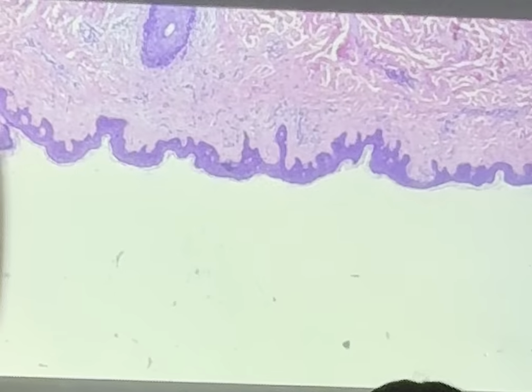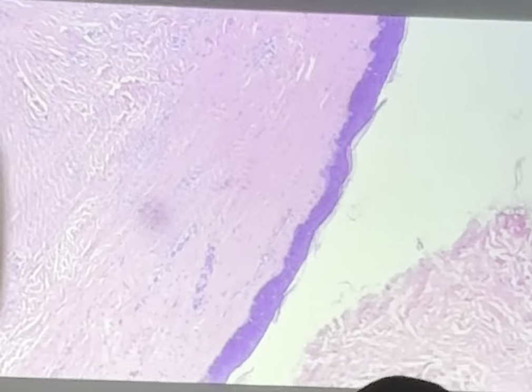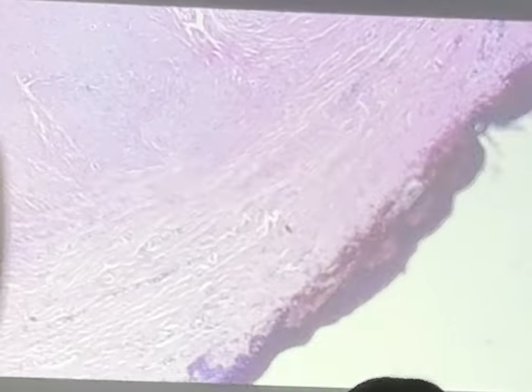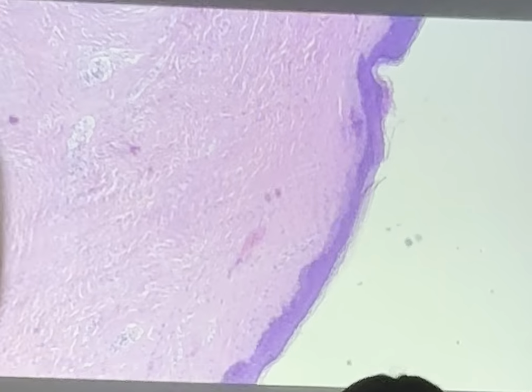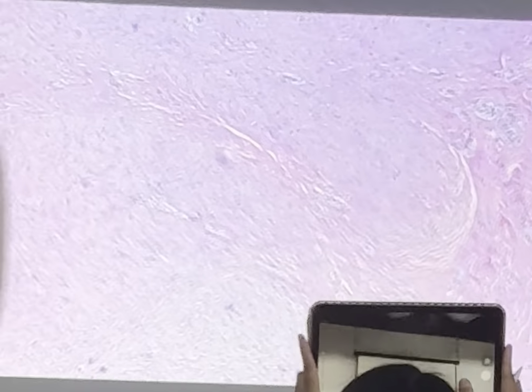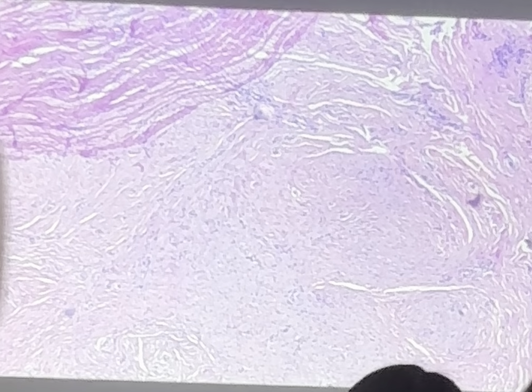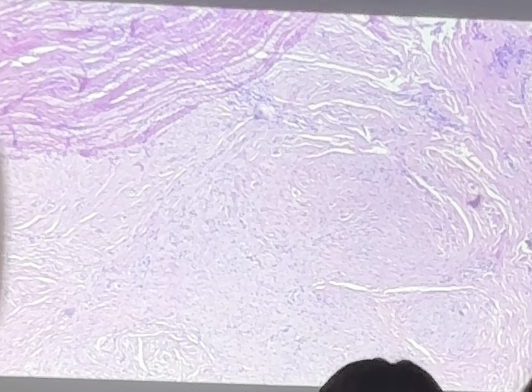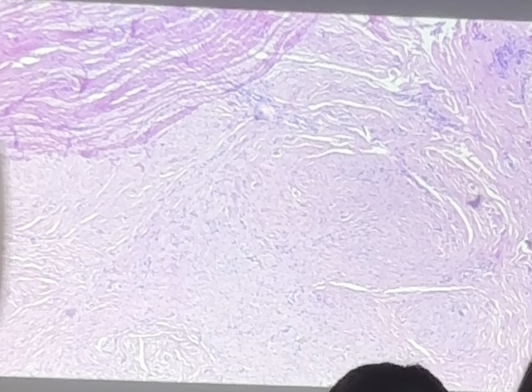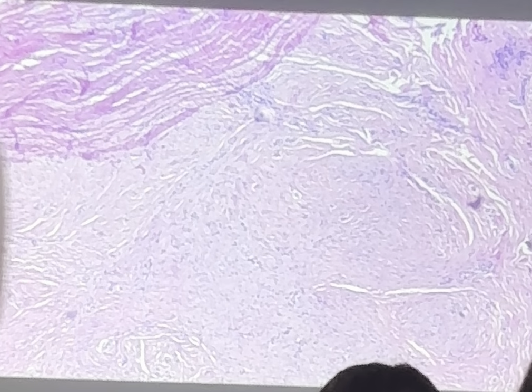Okay, so this is one organ, although it's upside down. Another skin. It is the skin. So here's the skin. Then if you look in the dermis, there's this vaguely blue nodule here. It's also well circumscribed. You can just draw an arrow, draw around it. This is another benign tumor. It's called a neuroma. I don't think you need to know this one. Just a little bonus. I want to show that to you. That was a neuroma. All right.